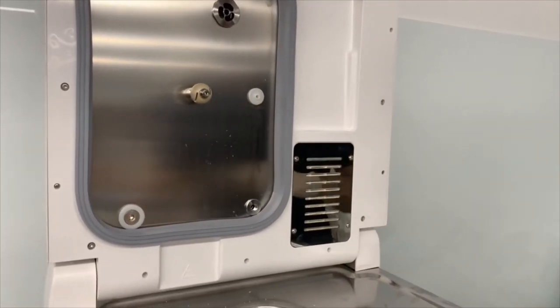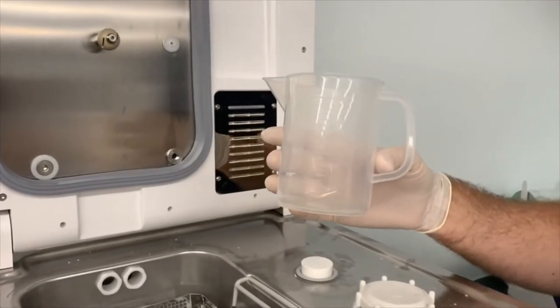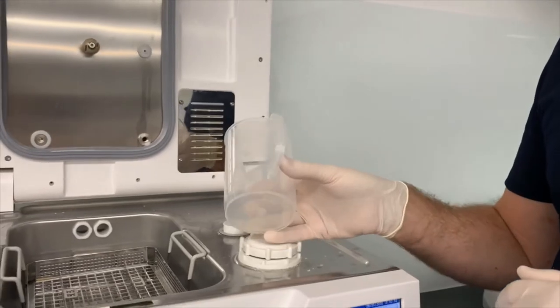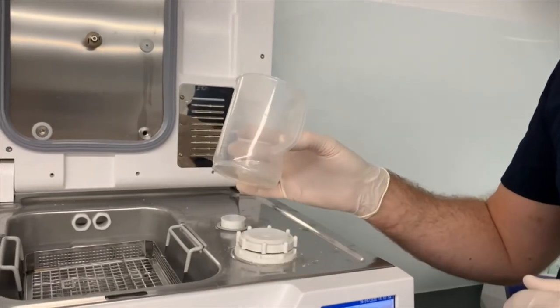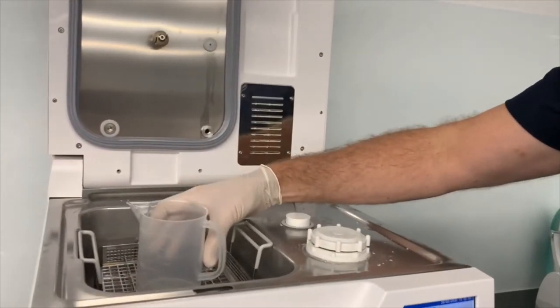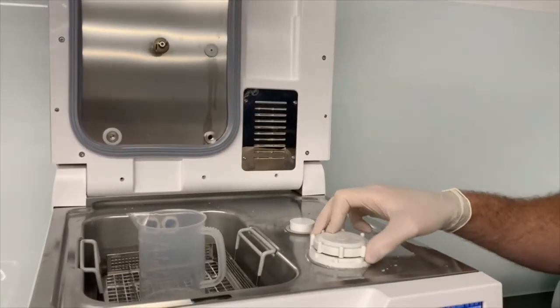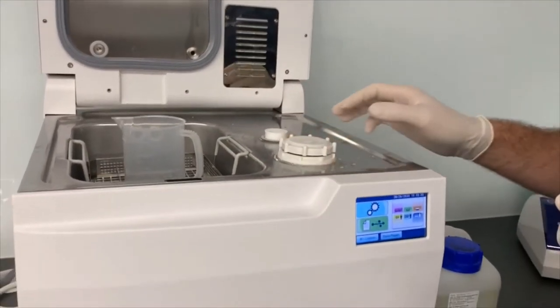Now if you can have ready the beaker or the catch cup that you normally use to fill the chemical up, it came with the machine. And we'll just run through that process of how to drain that chemical out of here and replace it with warm water to give it a nice flush through.